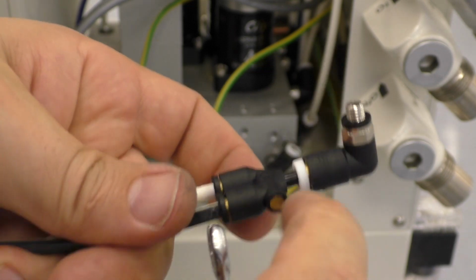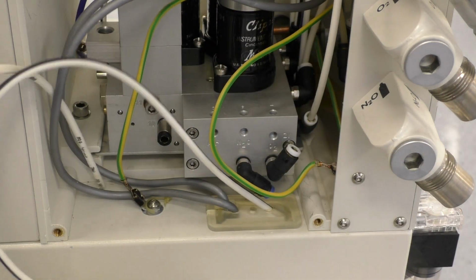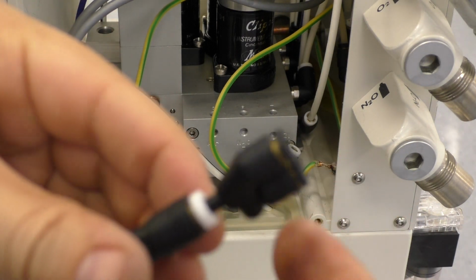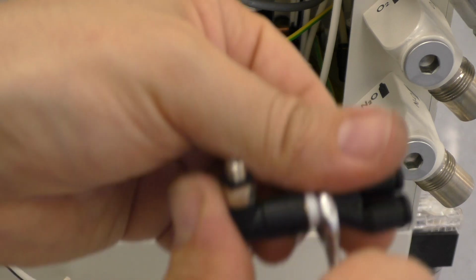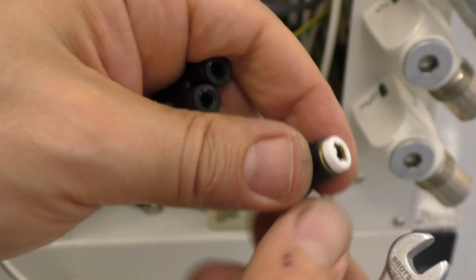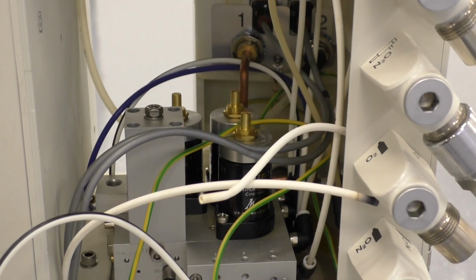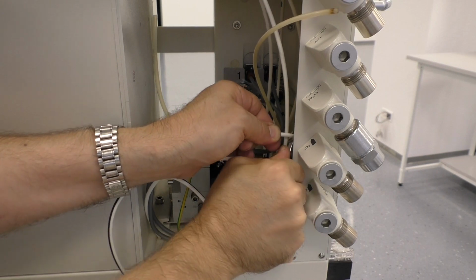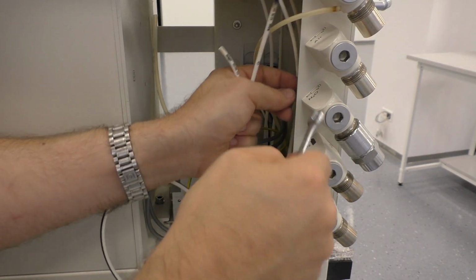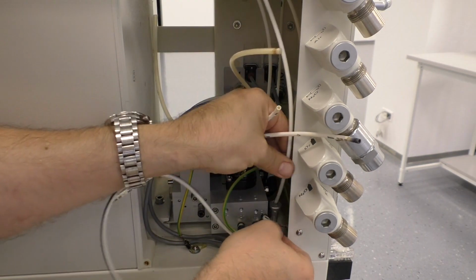Just what I said, it's like Lego, and you take it apart and it's easy to play with, and it's good for, I don't know, 10 bars or 15. Just press down the ring, and you even have it color coded. You have the blue ring for the blue line, a white ring for the white hose line. White is oxygen, blue is nitrous oxide, black is air, white again oxygen, okay, from another source.